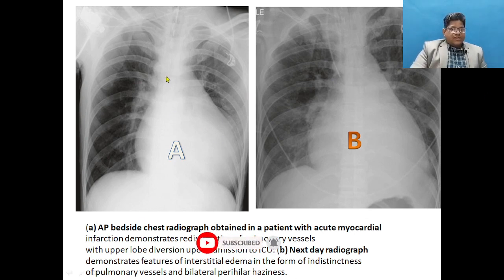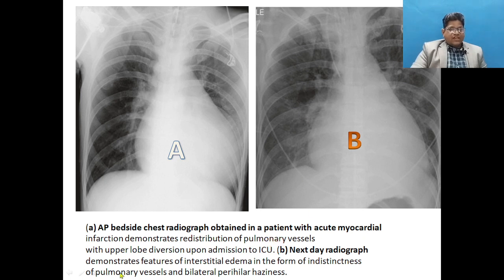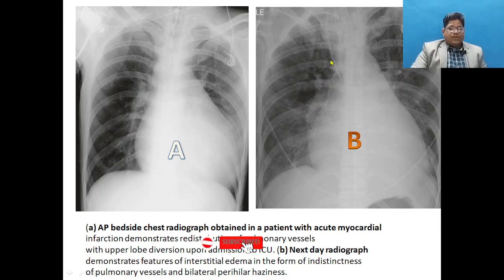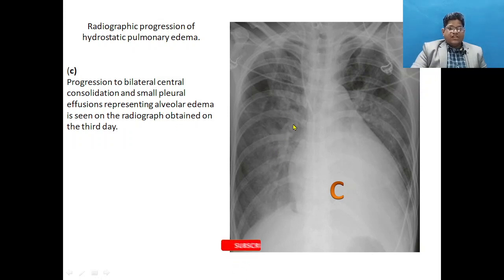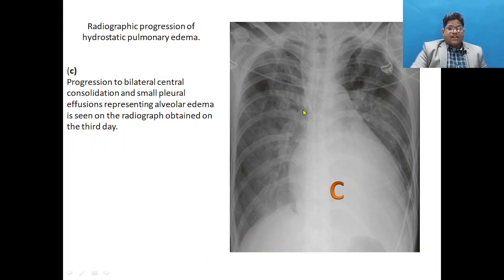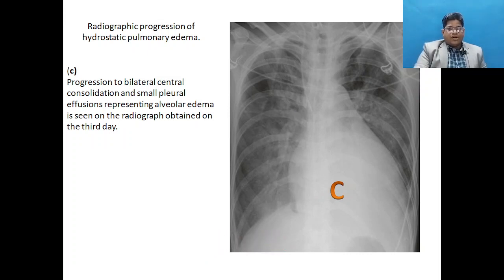Here is the AP bedside film of a patient with acute myocardial infarction, demonstrating redistribution of pulmonary vessels with upper lobe diversion on admission to the ICU. The next day we can see features of interstitial edema developing as indistinctness of pulmonary vessels, with bilateral perihilar haziness. In the same patient, there is progression to bilateral central consolidation and a small pleural effusion representing alveolar edema by day three, showing apparent cardiomegaly.